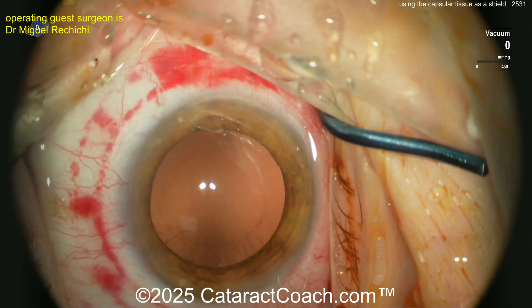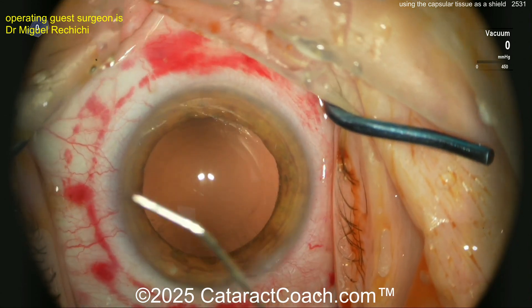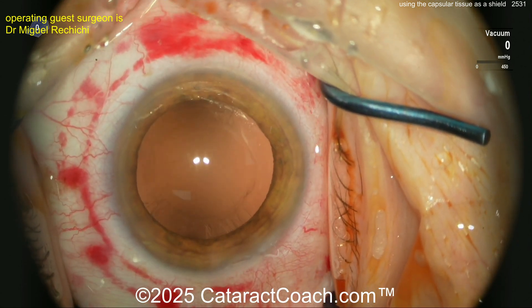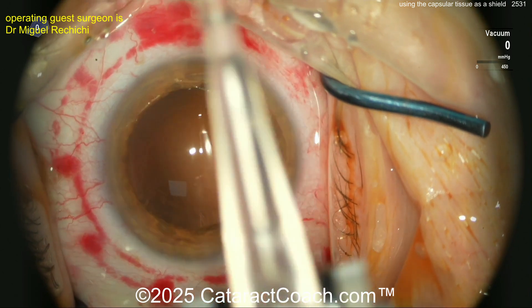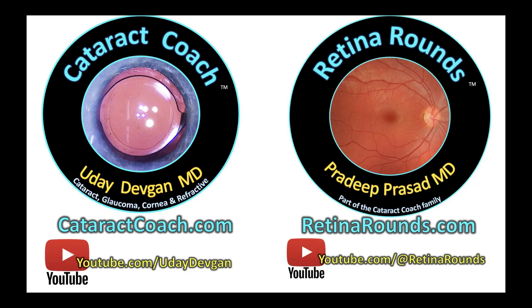At the end of the case, the capsulotomy is cleaned up nicely — well done. More viscoelastic to finish the case, the IOL is being inserted. Good positioning of the eye and nice draping. That's the end of the case. Check out retinorounds.com for anything posterior segment.